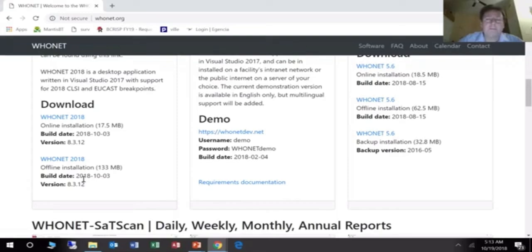It's very common in hospitals and other facilities that normal laboratory staff are not allowed to install softwares. The IT department does not want viruses and incompatibilities. They want to review softwares. So if you have any trouble with installation, first discuss it with your IT staff. If they have questions, then of course contact us here in Boston.